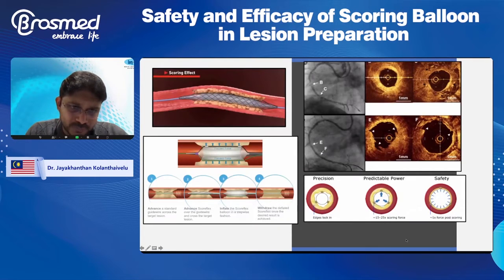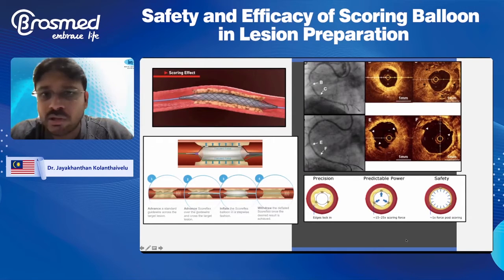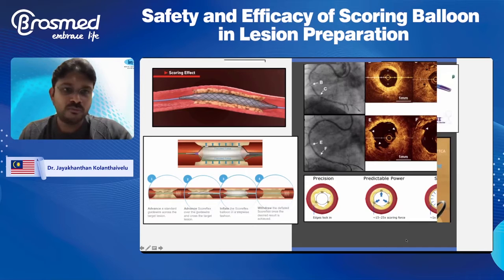So scoring gives a very focused force. If you look at this example that they've given, using our OCT, a scoring balloon is very predictable in giving you a very controlled dissection, and thereafter you're able to treat the lesion whichever way you see fit, whether it's a drug coated balloon or a stent, or whichever way you feel you want to move forward.